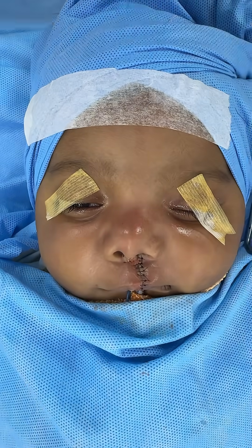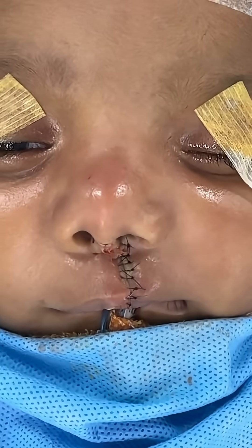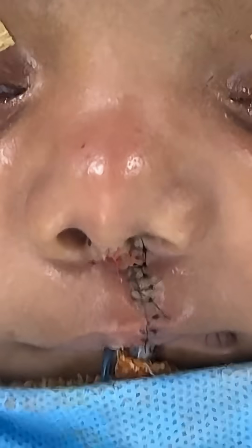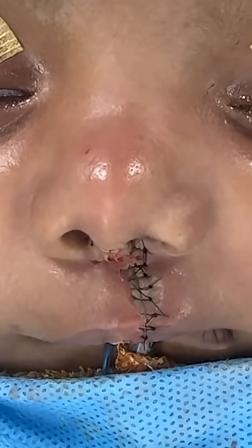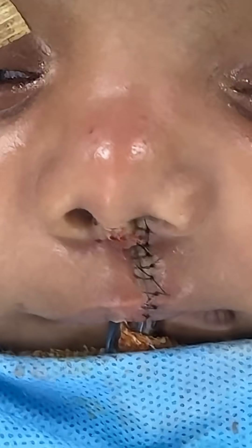We have just completed this cleft lip repair. I showed you before we started, and I'm going to show you closer. See how I placed the sutures on the filtral ridge.